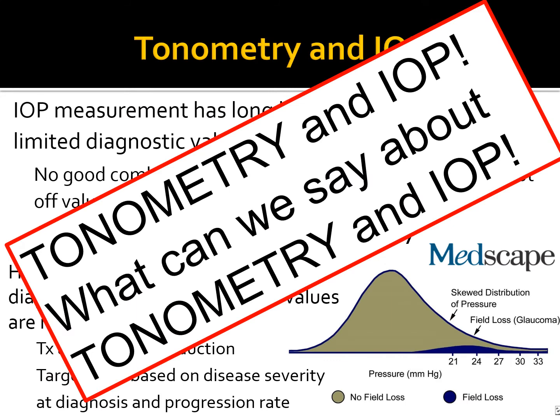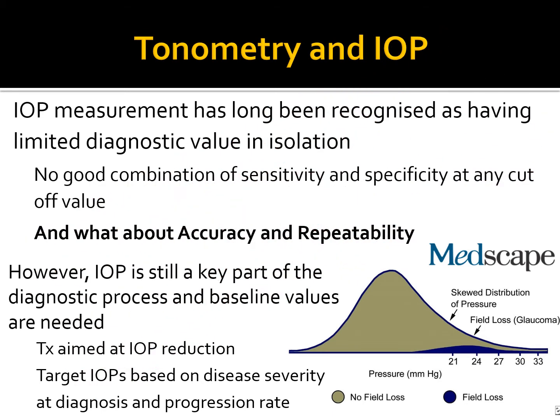So tonometry. What on earth can you say about tonometry? This section's quite long actually because I did my doctorate on this. It was called Tonometry, a Study in Biomechanical Modelling. And I have what I consider quite important, valid points about some of the things that are being presented to us these days. But certainly we can all agree that IOP measurements have long been recognised as having limited diagnostic value in isolation. And I think that's an important point, in isolation. No good combination of sensitivity and specificity at any cutoff points has ever been demonstrated.